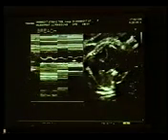There you can see. Are you concentrating on these points right here? This is what we mean by the contractility of the wall, which will give you the evidence of the problem. And the beautiful left and right ventricle, and there you can see these dots. So the contractility of that has to be picked up by these. It's an essential part of our fetal echo.